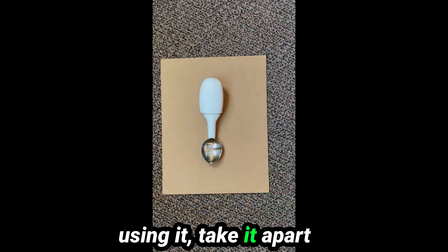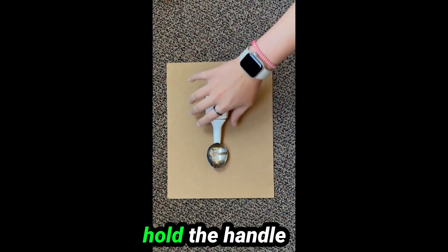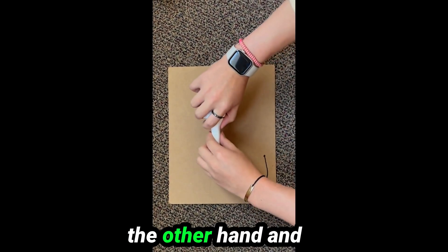Once you are done using it, take it apart to save the battery. When the attachment is off, the handle turns off automatically. Hold the handle with one hand and the attachment in the other hand and pull them apart.